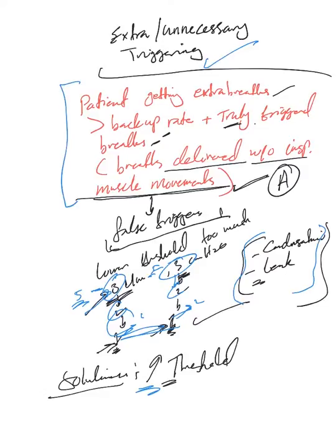If you see this here, simply increase the threshold for the pressure trigger or the flow trigger. As I said, it usually happens when it's very low. You just simply increase that.